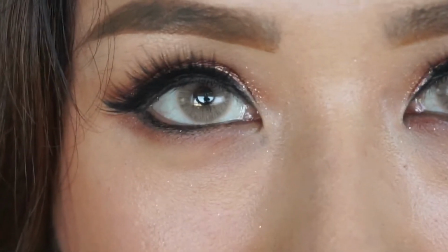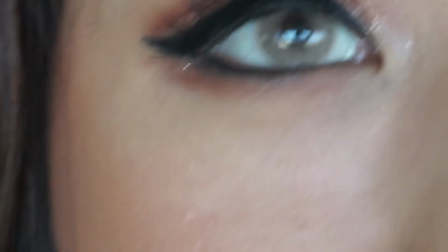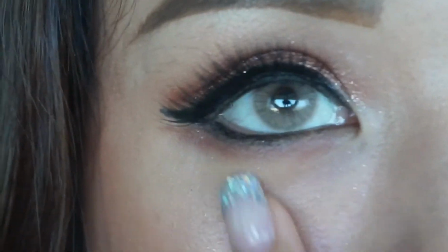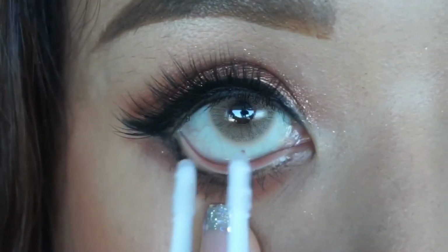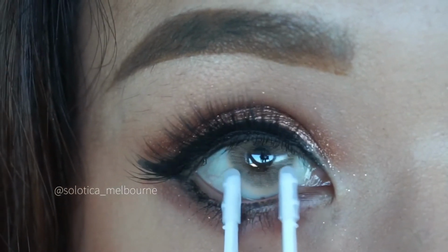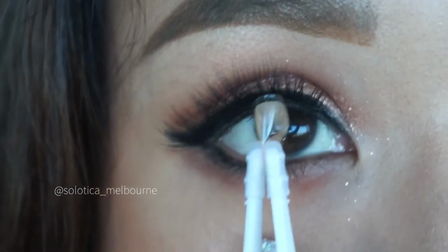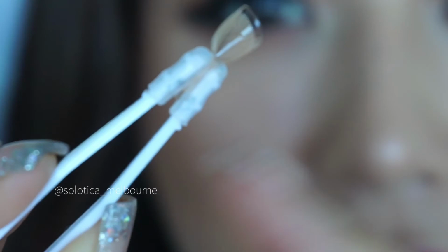Mind you, I'm actually looking at the camera, so it's not like I'm looking in a mirror. Okay, so what you need to do, let's zoom out a little bit. I don't really use my fingers, but because I've got makeup on, I'll just be like this and slightly squeeze. Sometimes you find that you miss, and that's it. It doesn't hurt because it's got that tip there. Can you see that tip there? So it's very gentle.